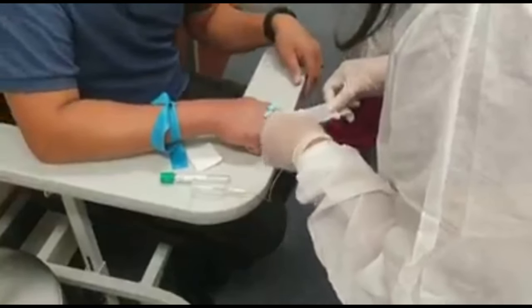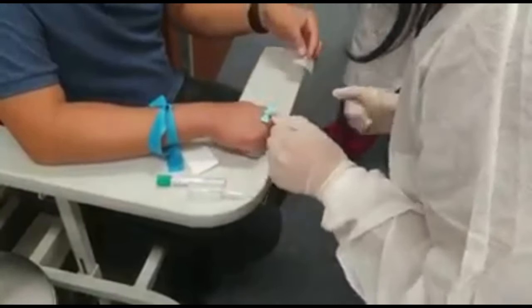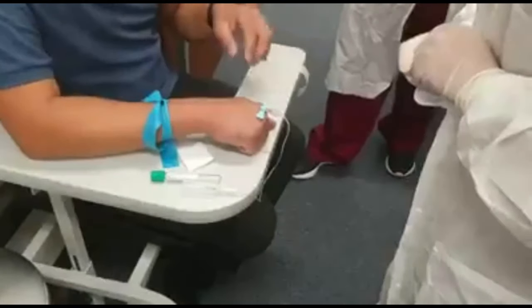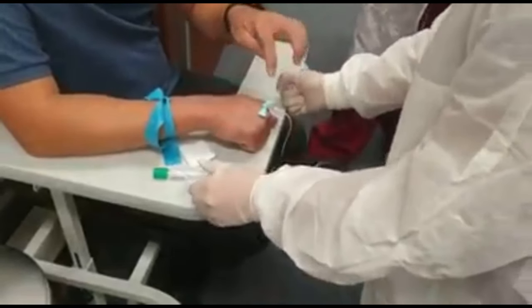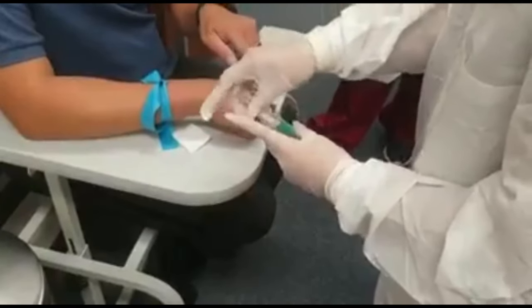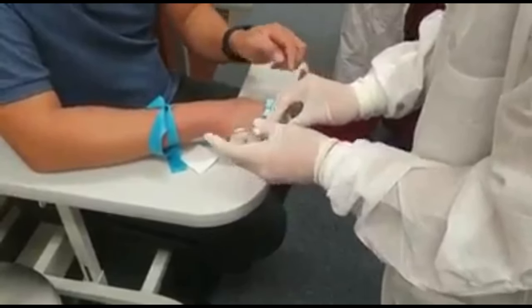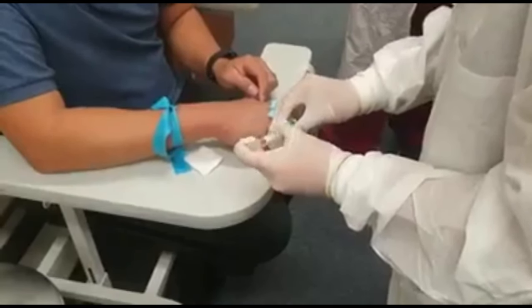Is this the one for the... Oh, it's fine. This is the tape for the gauze after. It's fine. So we'll just do it without the tape first. Go ahead and get your tube and put it in, and you can always let go. This is fine; it won't come out, as long as you don't tug on the line and you have some leeway. So go ahead and pop it in.